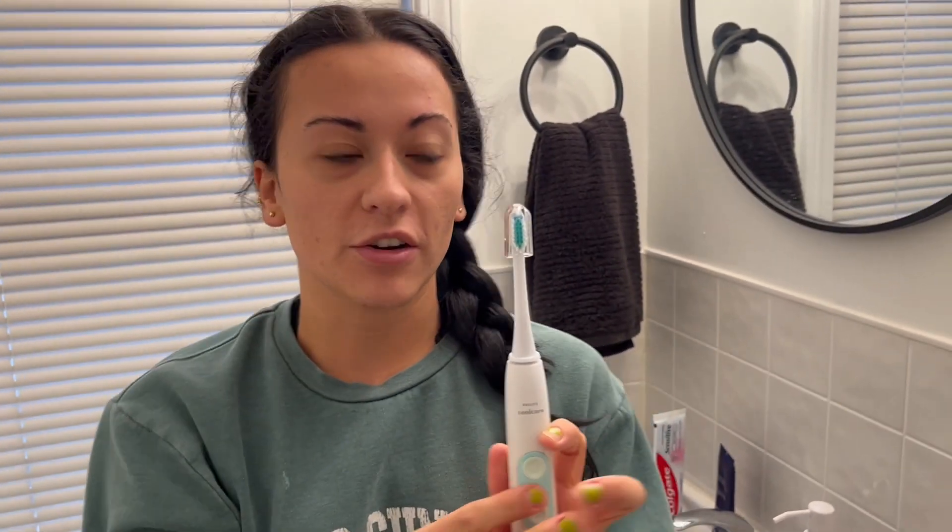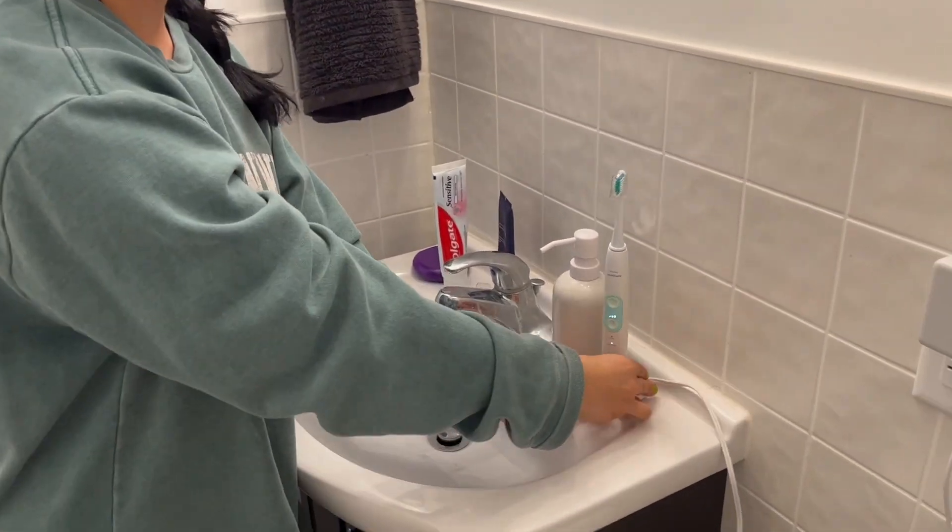These little caps right here come with it to keep it extra sterile, and it's super convenient and really easy for storage.